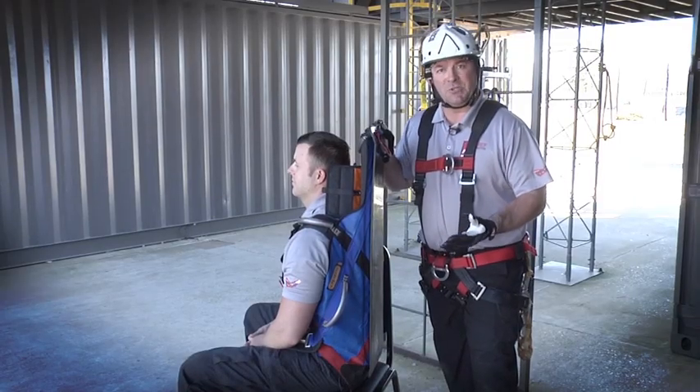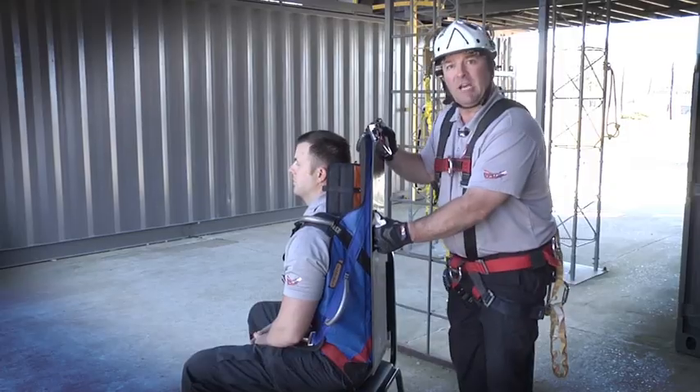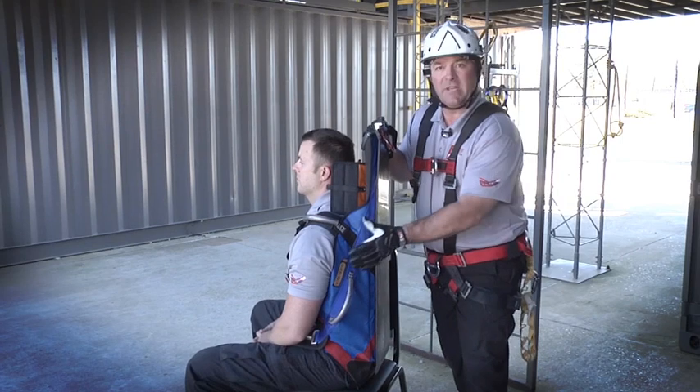Let's talk about some nomenclature of the SpecPak. This device weighs about 15 pounds. Notice on the back here we have a nice solid rigid plate. This does a couple of things for us — it provides a lot of protection for the patient when we're dragging them through confined spaces, and it also protects our device.